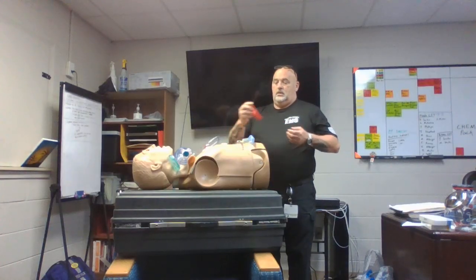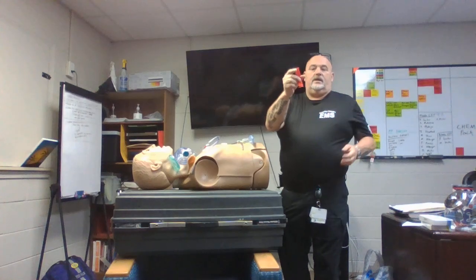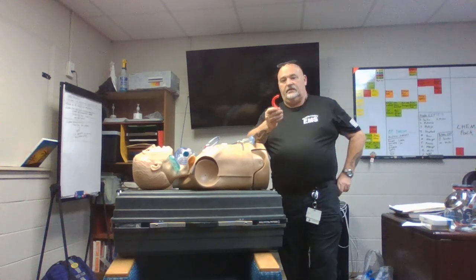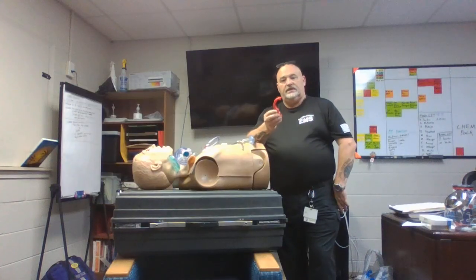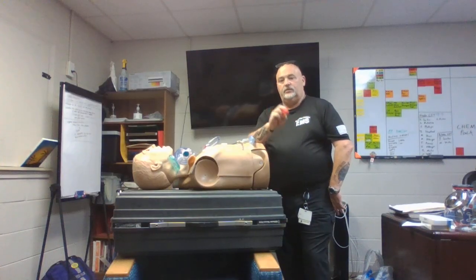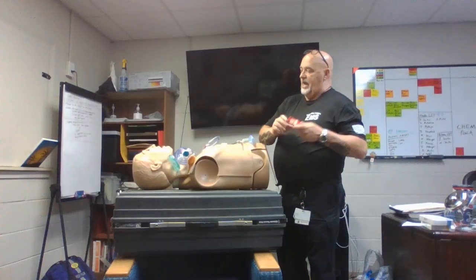So OPAs, right? Everybody's like, oh, it's the J shape. Yeah, it is. And for years, the AHA said this was an acceptable means of airway management in a cardiac arrest until you got ROSC. Then you could pull this and put an ET tube in. Over time, we've switched away from that.